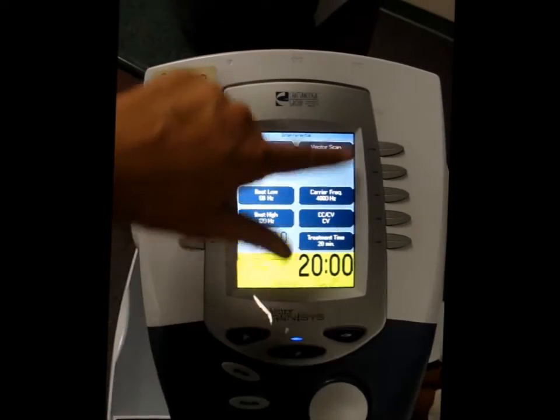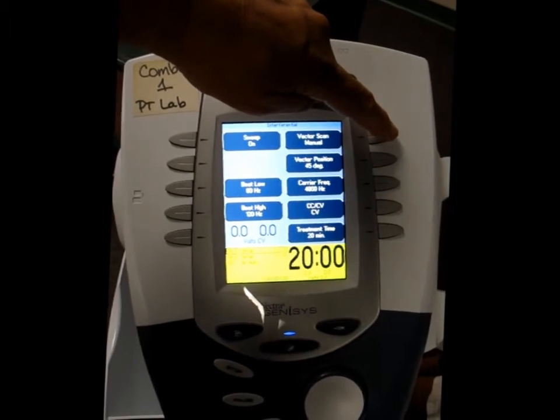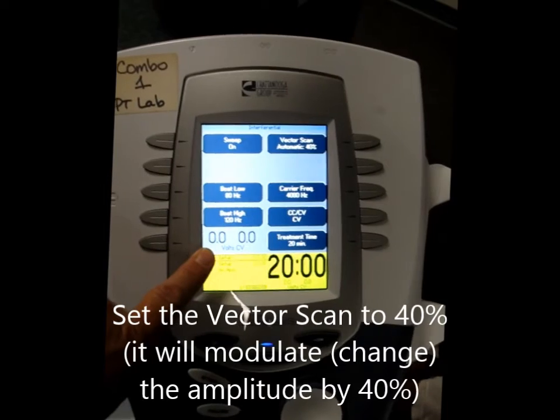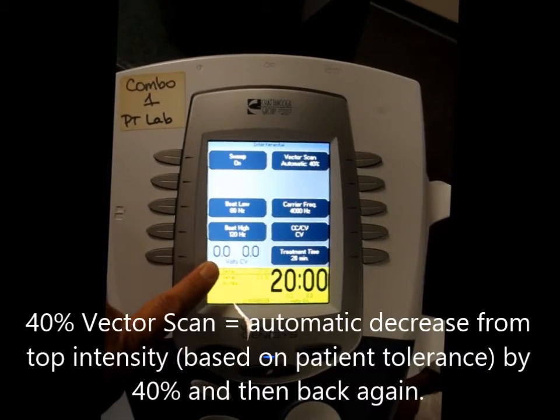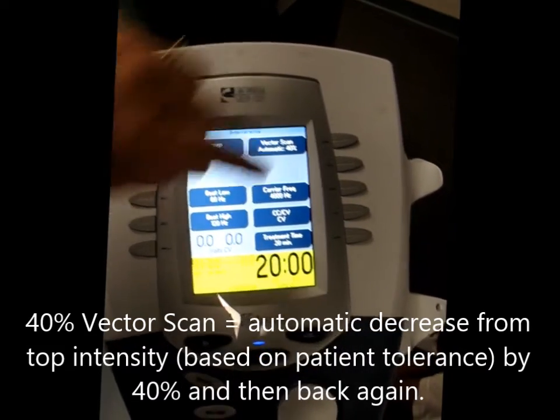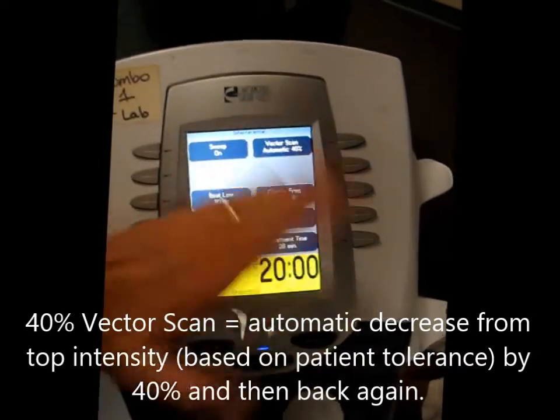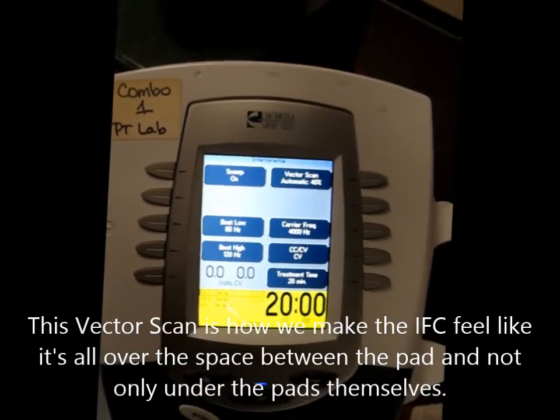I'm going to be doing the treatment here, and when I turn this on, I'm going to be using a vector scan of 40%, which means let's say she gets to a 10-volt CV of her intensity limit. When I hit the start button, it'll actually vector down 40%, so it'll go down from 10 to 6, back to 10 to 6, and it won't do it at the same time. That's how the patient feels like a sweeping motion when we do the interferential treatment.